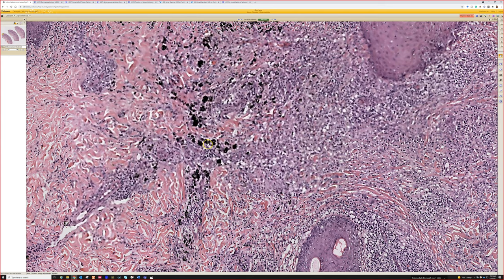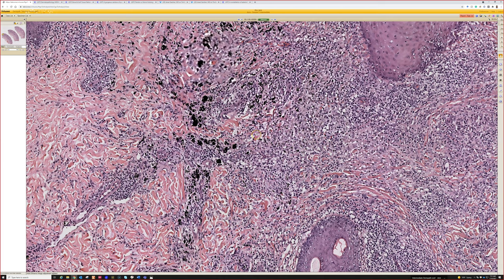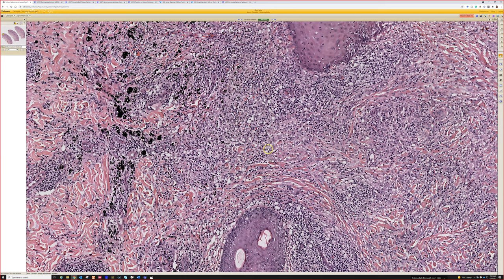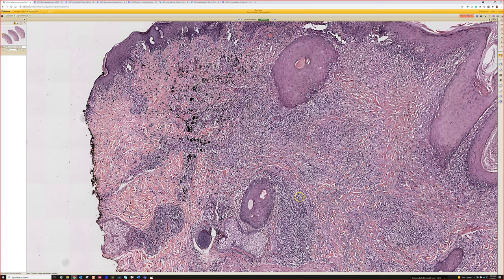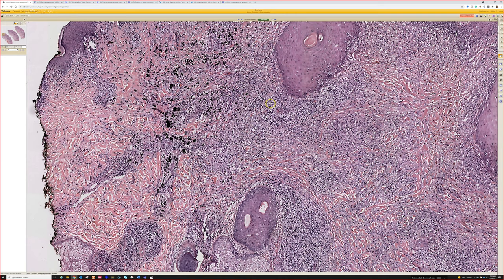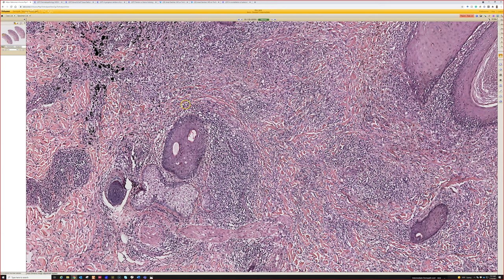The little round dots are going to be lymphocytes, and cells with more abundant pink or gray cytoplasm are usually histiocytes. Even from low power, if you see an infiltrate that's very blue, it's probably lymphocytes or other round blue cell things. If you see some gray and pink areas, that means there are probably histiocytes in the mixture. Or as you get closer, you could think of other things like tumor cells that have extra cytoplasm. But if it's all inflammatory, round dots are lymphs and grayish cytoplasm is usually histiocytes.